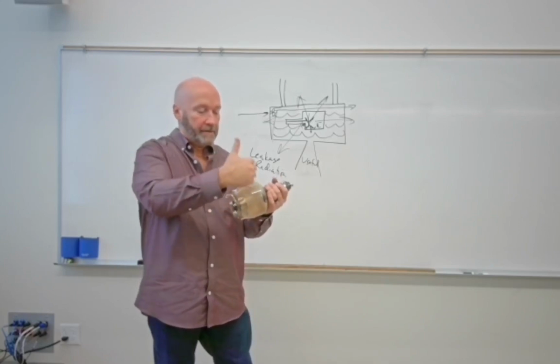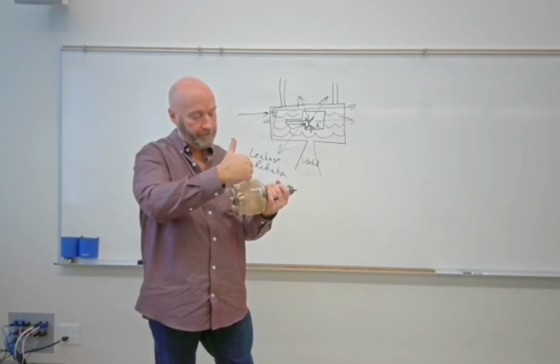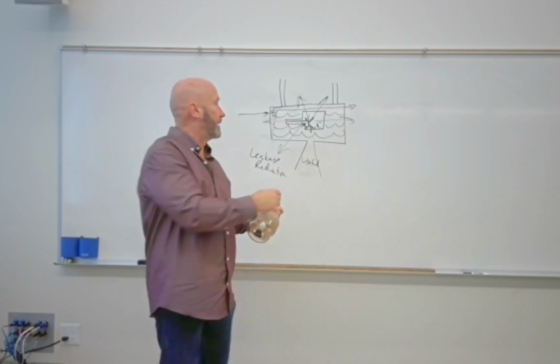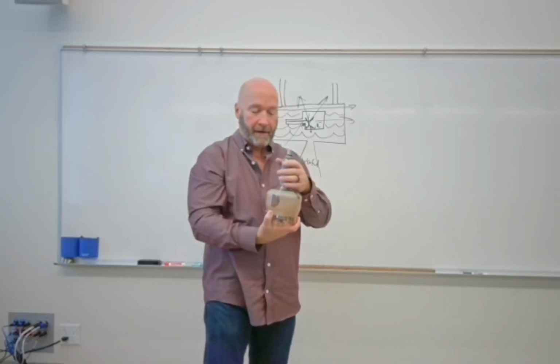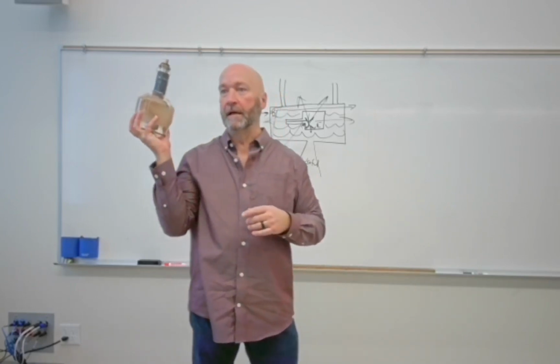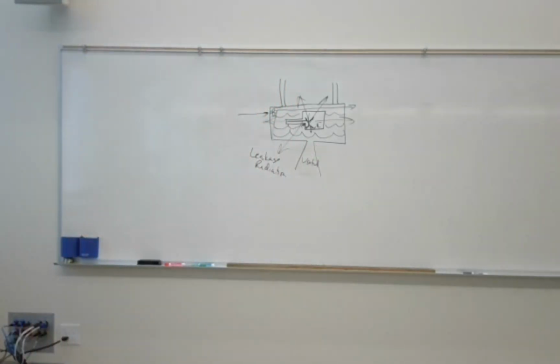And certainly look at the anode and the bevel on the anode. It's not just flat like what I've drawn up here, but it's got a little bit of angulation on it. Then finally look at the back side of the anode. It looks different from the front side. We're going to talk about all that stuff. So I'm going to pass this around. Once you eyeball that, this is the cathode. Pass that around.